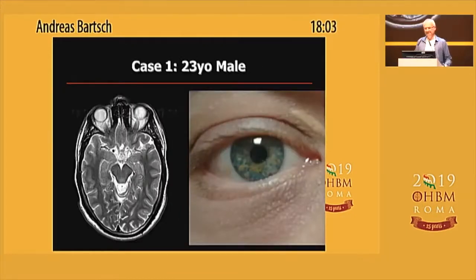First case. Anybody knows what this is? I have no chocolate anymore, but I just delivered one. So any idea what this patient has? So what's not normal here? On the T2, well, look at the eye first. Patient comes first. This is not normal.